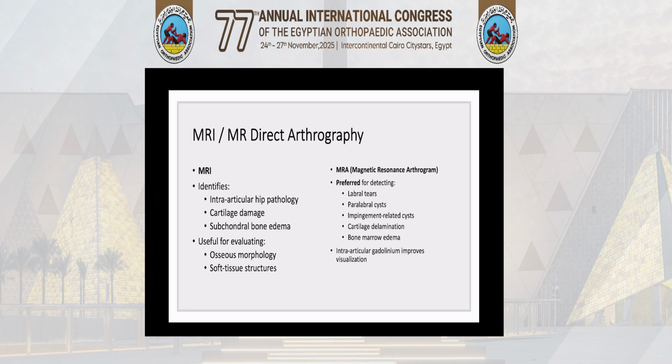And sometimes we ask for high resolution MRI to avoid the complications of local intra-articular dye injection. The MR arthrography is better at detecting the labral tear, the paralabral cyst, the chondral damage, and impingement-related cysts.